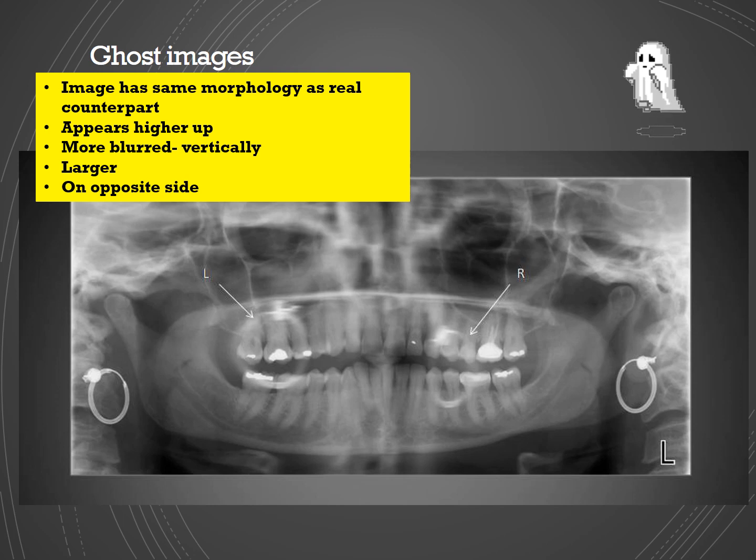That is any necklaces or hairpins, earrings, nose rings, all of these have to be taken off, external jewelry. But if the patient is wearing braces, for example, that is something you cannot get rid of. And do they cast ghosts? Yes, they do. And what about FPDs? What about implants? Now, implants luckily don't really cast much of a ghost because they're within the bone structure. But FPDs can be nasty and can cause a lot of ghosting.